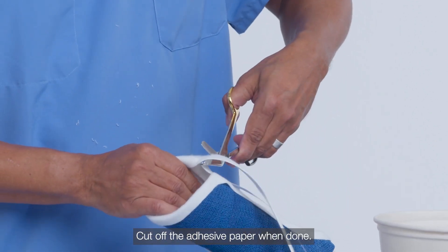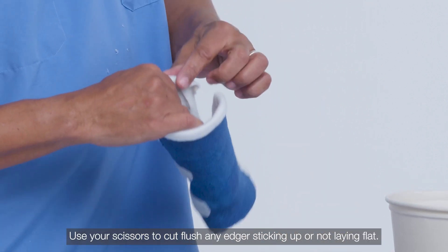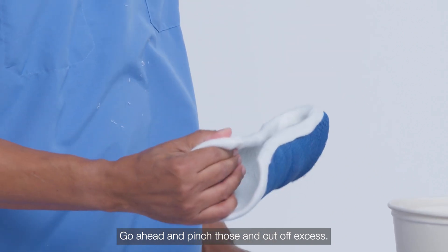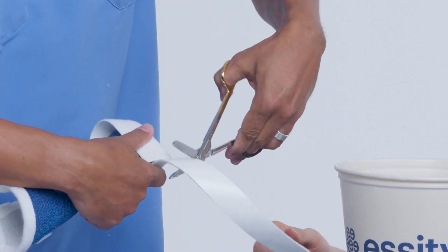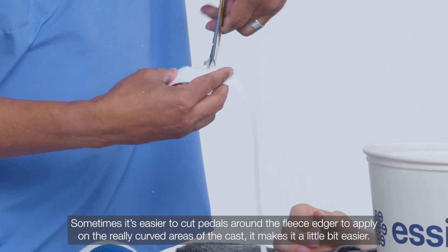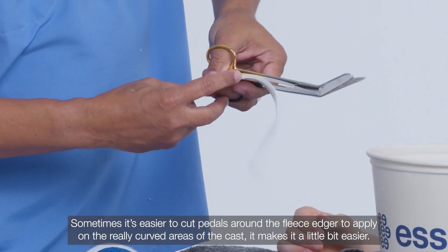Cut off the adhesive paper when done. Use your scissors to cut flush any edgers sticking up or not laying flat — go ahead and pinch those and cut off excess. Sometimes it's easier to cut petals around the fleece edger to apply on the really curved areas of the cast, as it makes it a little bit easier.